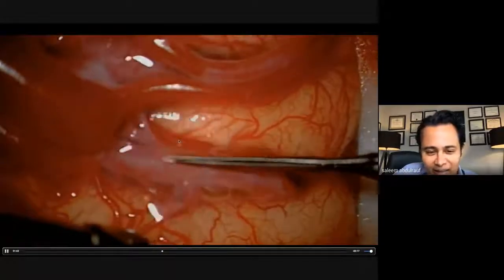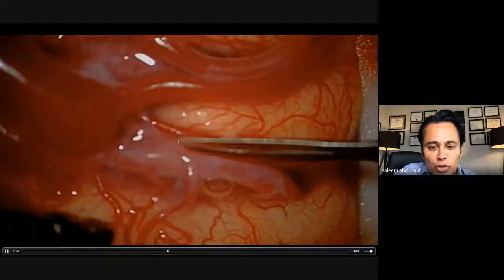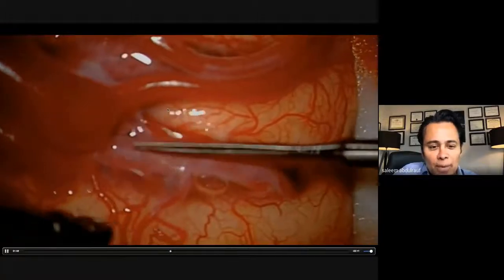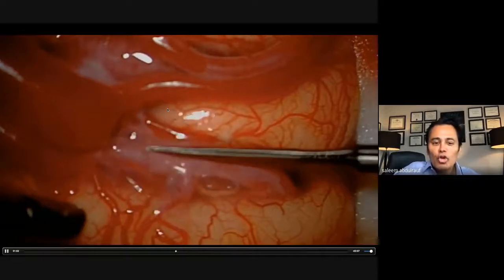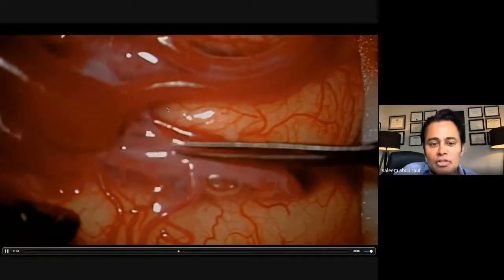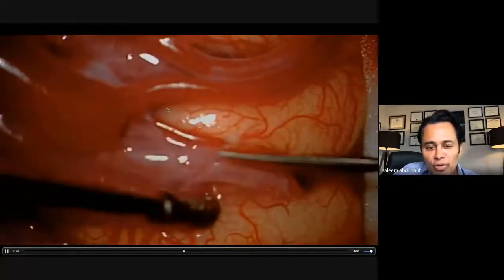We could discuss that another day, but I'm just trying to discuss technique issues as we're doing it, okay? Sharp, sharp, sharp dissection. A lot of control versus pulling and you don't know what you're gonna tear, all right? So that's counterintuitive, but it is actually the truth, okay?